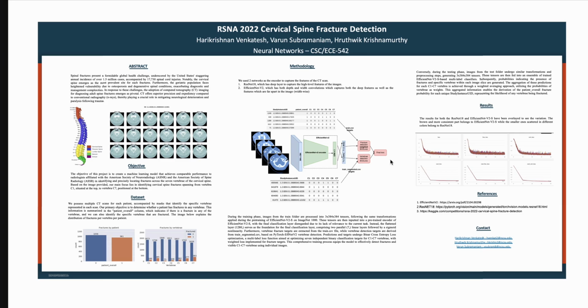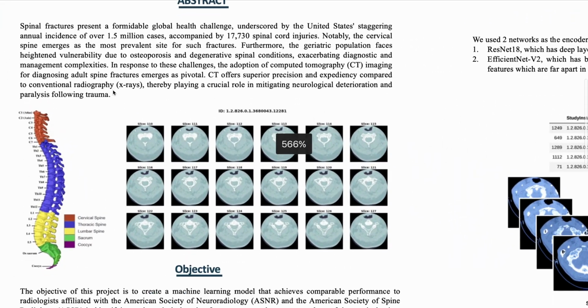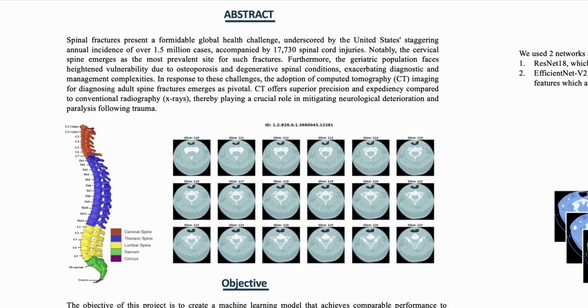Our project is RSNA 2022 Cervical Spine Fracture Detection, which was taken from Kaggle. So, to give an overview of what our project does, we try to find out if there are any kind of fractures in the cervical area of the spine.